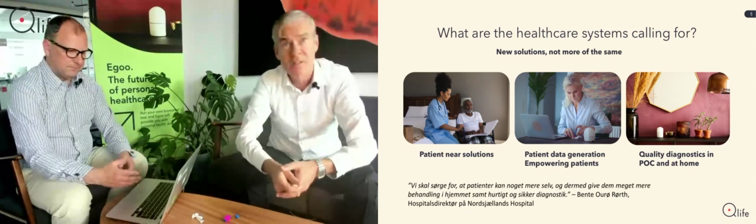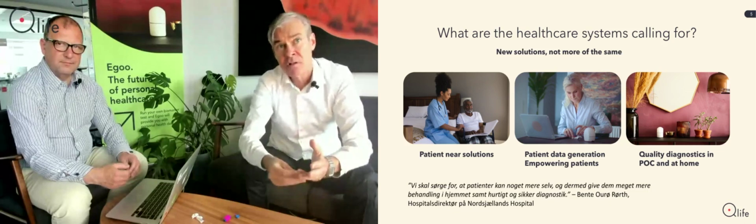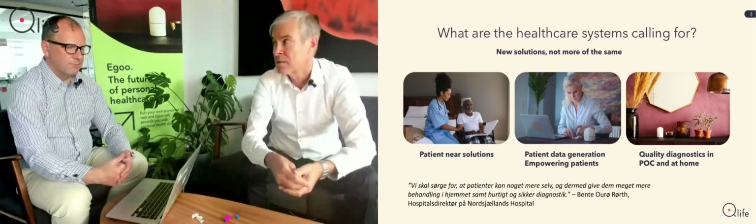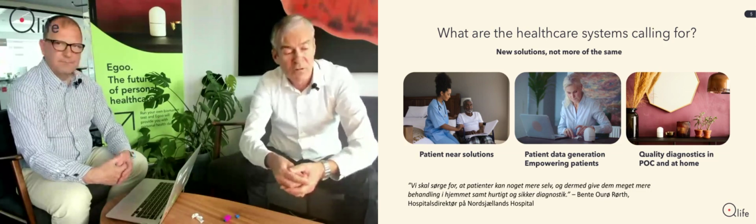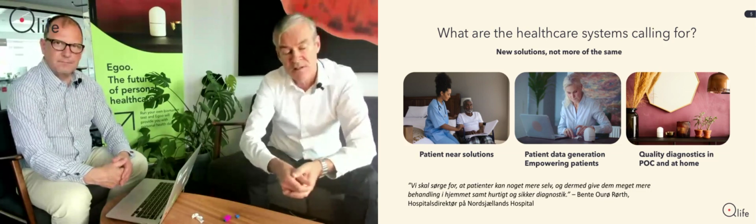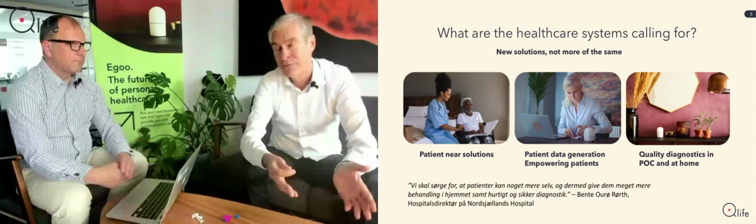And we are going to participate in trials here in Denmark, where the idea is to keep patients hospitalized, but in their home. And of course, to do that, you need to be able to monitor specific biomarkers. These people are typically quite ill. So here we are talking about infections that are quite high, and it's obviously critical to be able to measure that very precisely. That's an area we are very interested in, but we are not going there before we actually are CE marked approved, because it's very clinical.